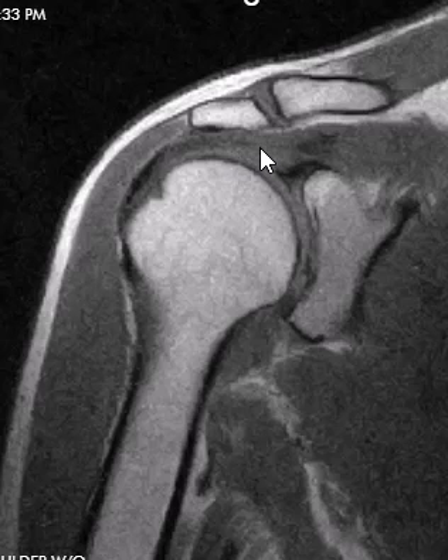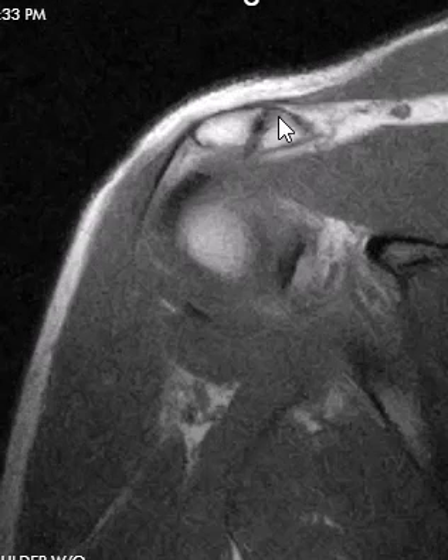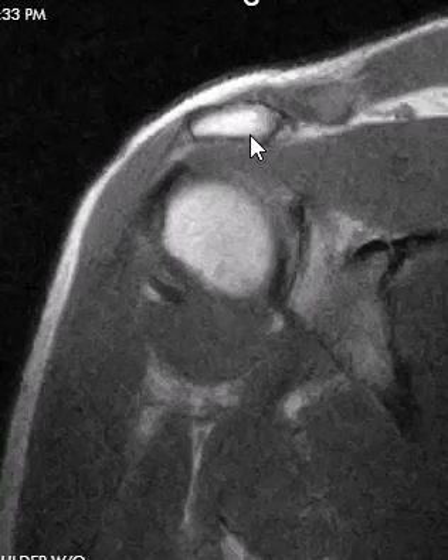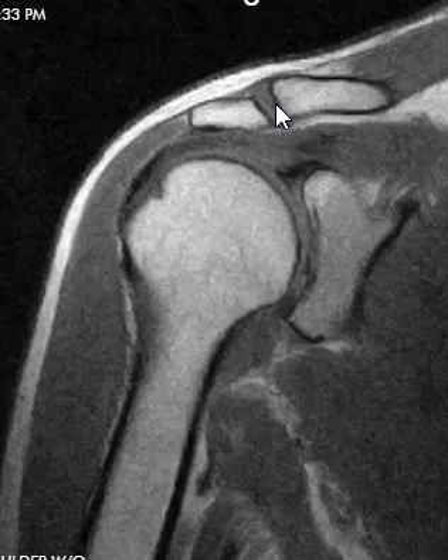So when we see this, we wonder: do they have any reactive marrow signal changes? Do they have any spurring associated with it? Even without spurring, it may tilt down and cause rotator cuff problems and impingement.